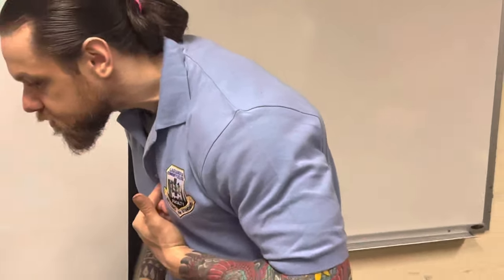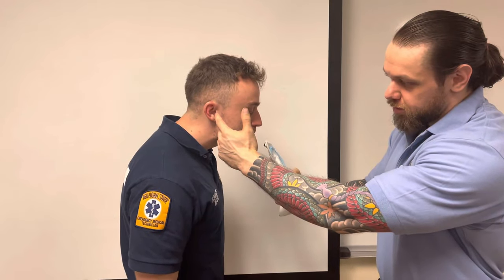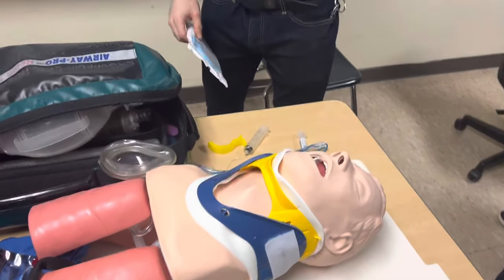Remember how I was showing you - ear to the sternal notch and the way we do it, we use padding. If we did this for a patient with a cervical spine injury, we could potentially cause damage or harm. If he's got a C3/C4 injury, we don't want him to be paralyzed or impair the phrenic nerve and diaphragm and his respiratory functions.